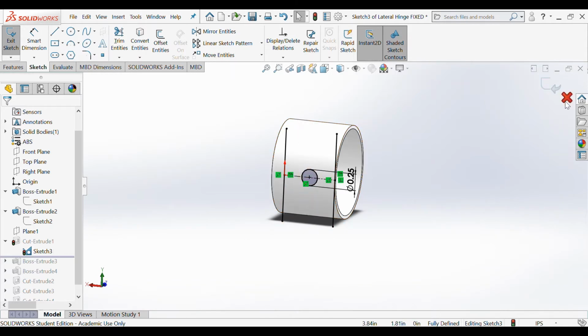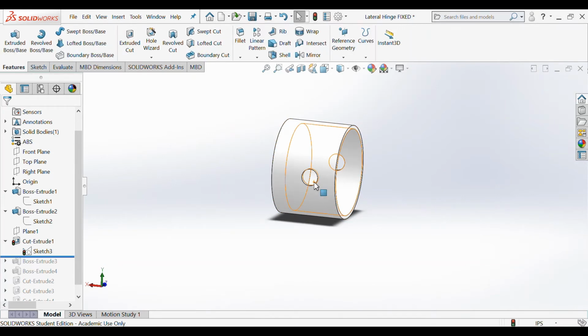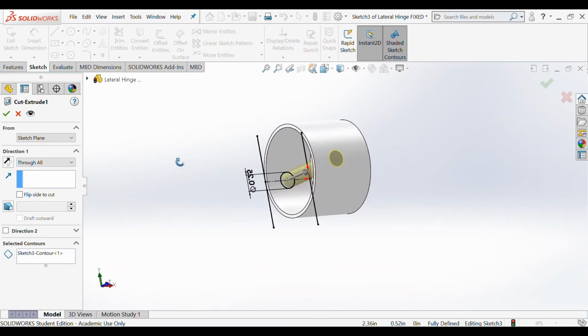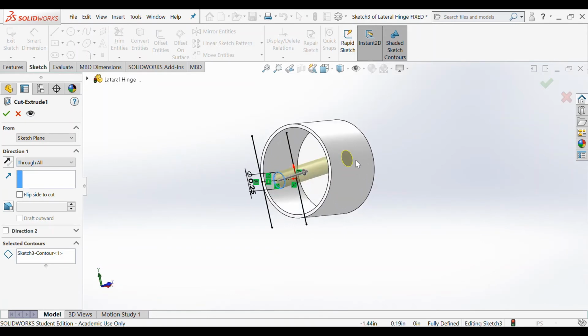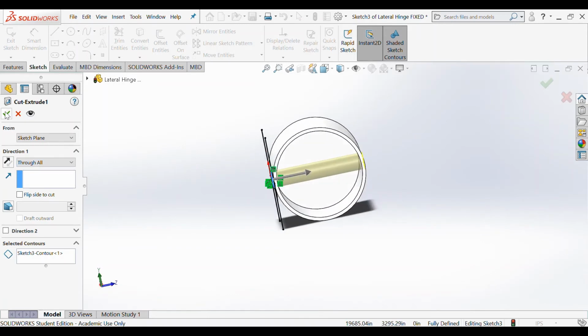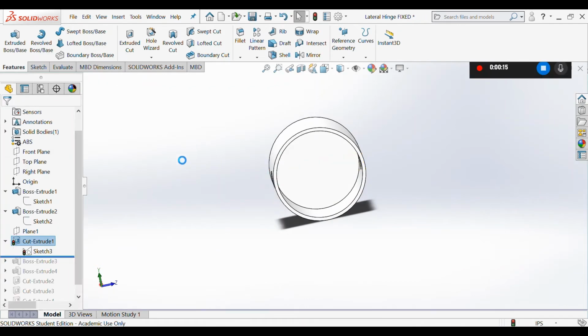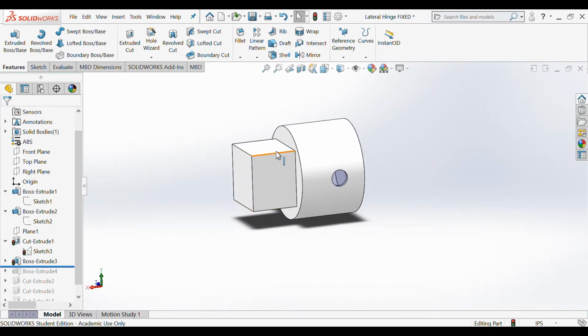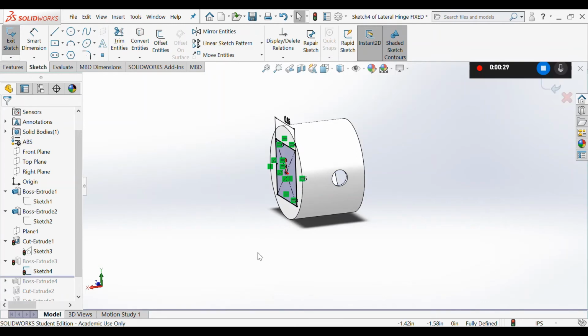Now that we have created this sketch, we can go on ahead and cut extrude it. Now for this cut extrude, we are going to choose the through all option, so it will cut directly through the piece, so we'll have two holes, and we'll click that green check mark. Now that we have this piece right here, we're going to go on ahead and draw another sketch, which is going to give us this extrusion. So let's go on ahead and look at that sketch.